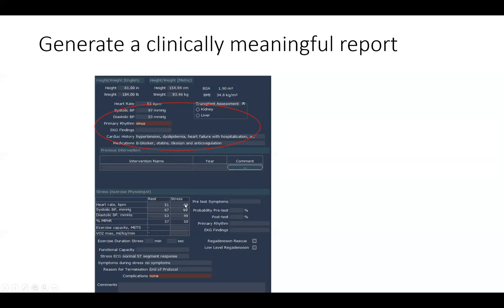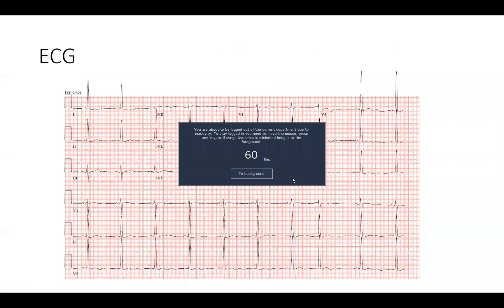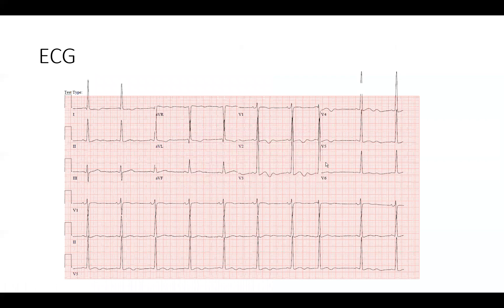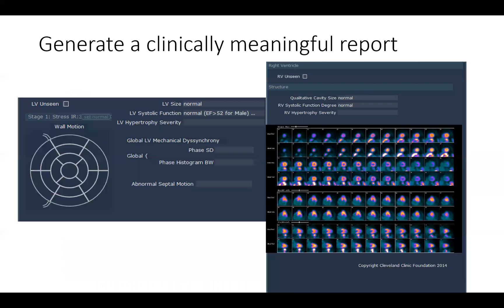Again we can look at this for quality assurance — this is heart rate at rest and immediately post-stress, going up to 69 with a slight drop in ejection fraction. This is with regadenoson, and because we're doing PET here we're imaging at peak stress under the camera, so all stress images are acquired at peak stress. Here is the patient's EKG and you can see this person has significant left ventricular hypertrophy with T-wave changes and almost Q waves at the end, reflecting what we're probably going to see next.